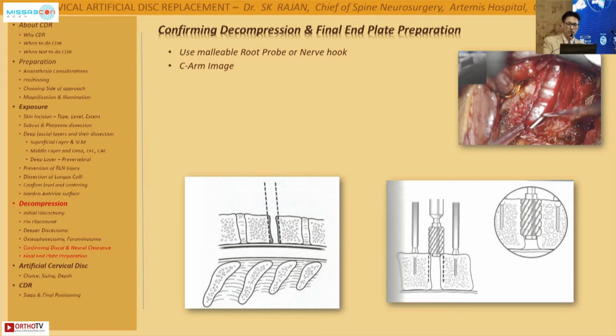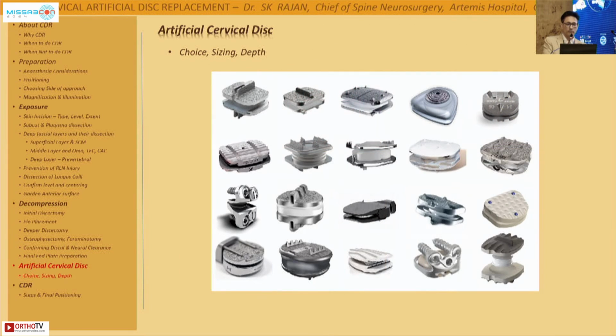And similarly, you have to make sure that the deepest part of the vertebral body is completely taken care of, because often we find people will put an artificial cervical disc and that disc will come out anteriorly because they were not able to push it deep enough. So sometimes you have to dissect deeper in the deeper part compared to the cranial superficial part, but it's extremely important for your disc to hold.